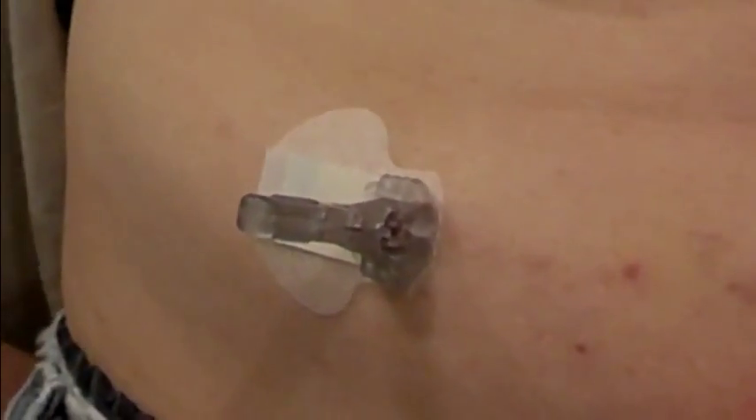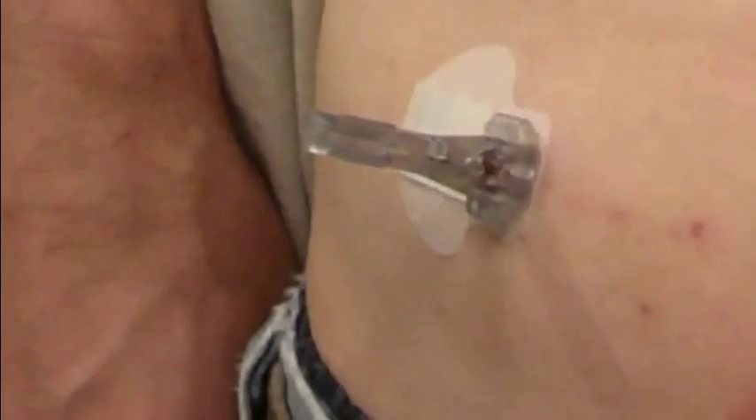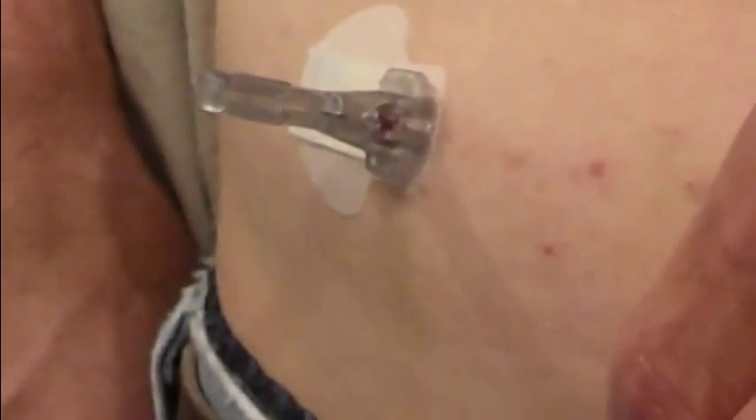I'm taking this video because this is about the fourth time that I've had problems. You can see that there's some bleeding going on underneath the plastic. That's because I've been sitting here for about 15 minutes trying to retract the needle device. The part that sticks out perpendicular from my body is supposed to be easily removed. However, this one is not, and this happens about a third of the times.